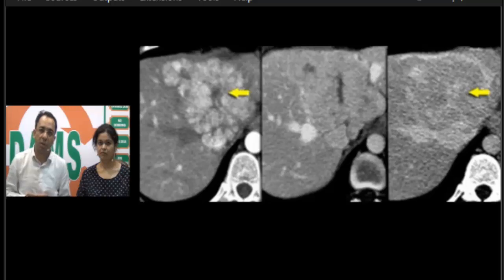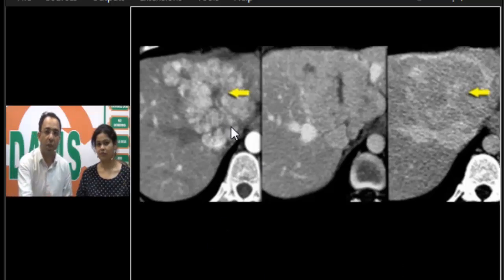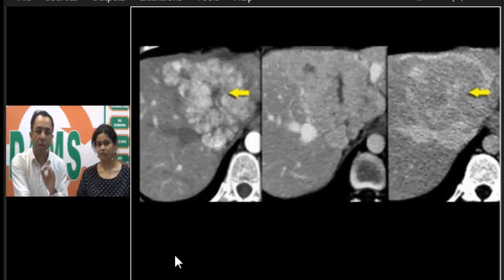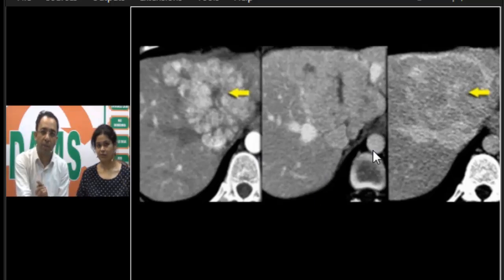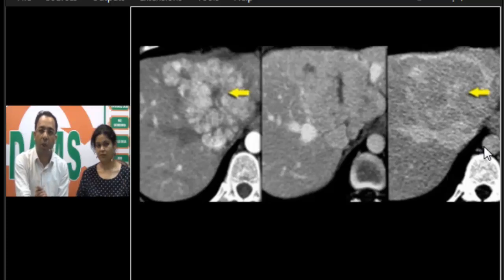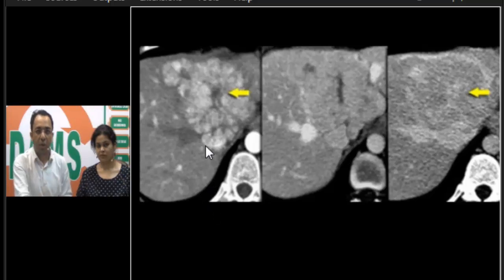Let us look at the CT image. There are three images because this is a triple-phase CT of the liver. The first image is the arterial phase — hepatic arterial phase done around 25–35 seconds — look at how white the aorta is. The second image is the portal venous phase where the dye has moved from arteries to veins. The third is the delayed or parenchymal phase.